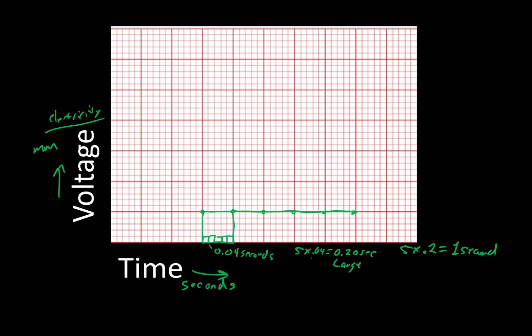When there's no electricity flowing, you actually have nothing going on. And what the paper does and what EKGs do is measure how much electricity total at that very instant in time is flowing in any one direction, whether it's flowing towards the electrode, making it positive, or if the electricity is flowing the opposite direction, which makes it negative. But it just adds up how much electricity it sees, plain and simple.